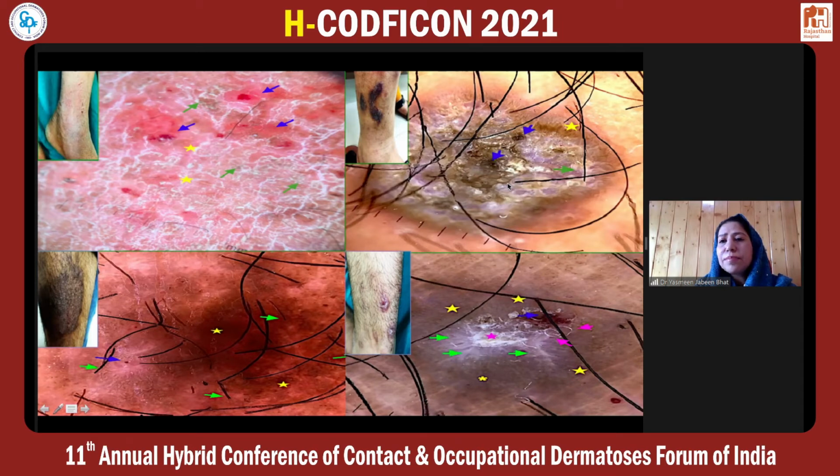This is lichen planus hypertrophicus, showing these follicular plugs, what we call the comedo-like areas, and pigmentation in the periphery, as well as the vessels which are radially arranged. Then this is the case of prurigo, where we see excoriations, this starburst appearance, the adherent fabric fiber sign, and pigmentation in the adjacent area. So this is how it can make our diagnosis very easy.